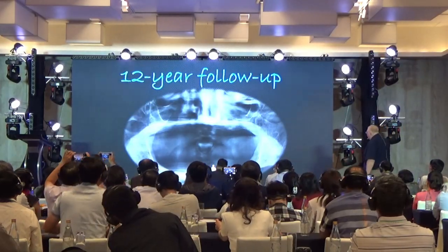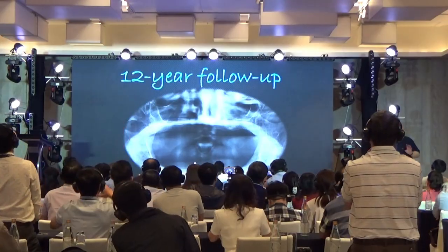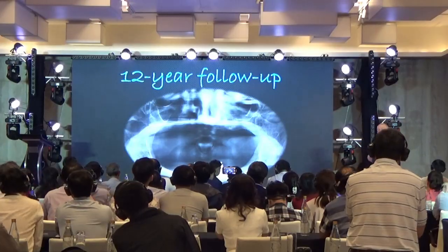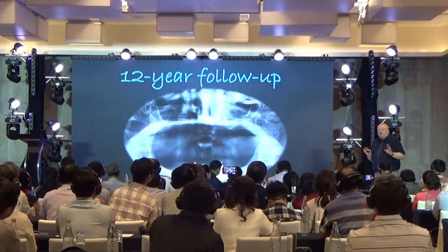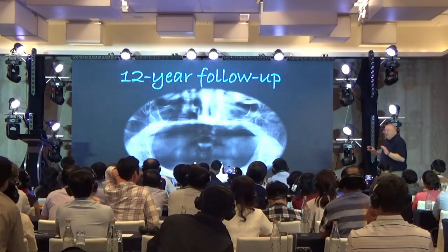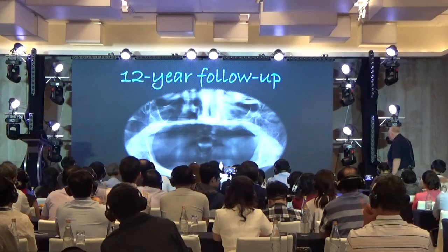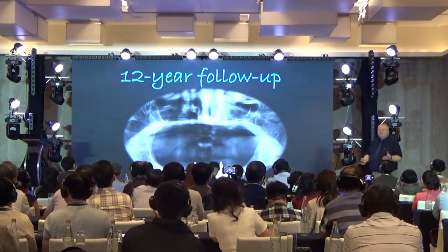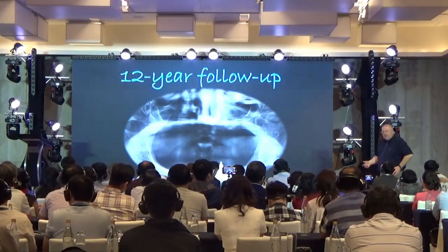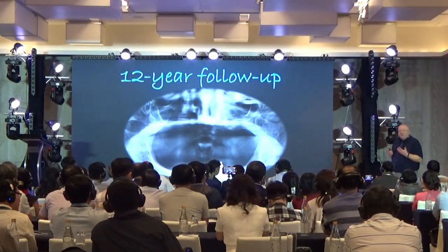And this is how it looks after 12 years. This patient, she's in love with me. And she comes every year with her panoramic radiograph. So this is a 12-year follow-up on the case. And it really looks very, very nice. I'm very satisfied. She comes, I tell her everything's okay. She goes with the hygienist and she keeps it in place.